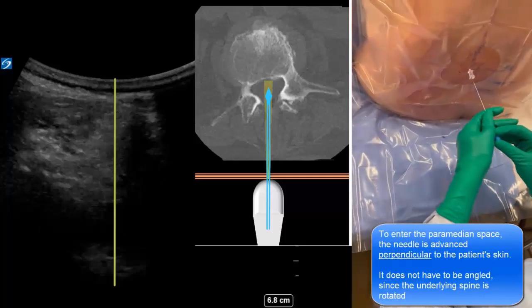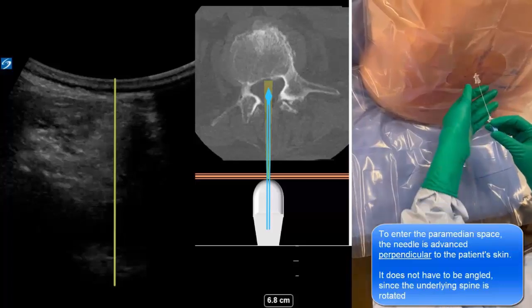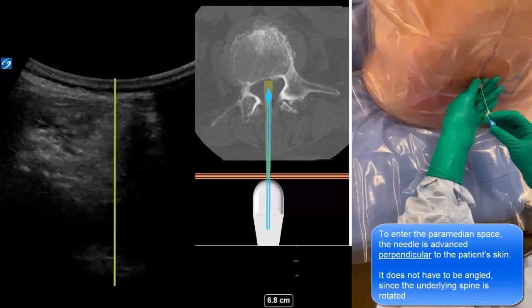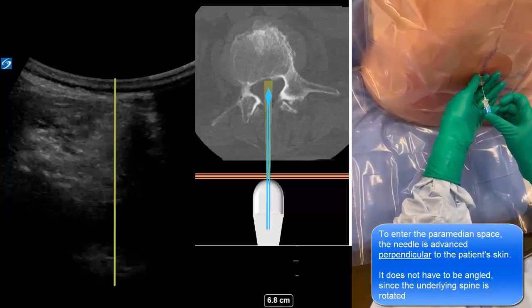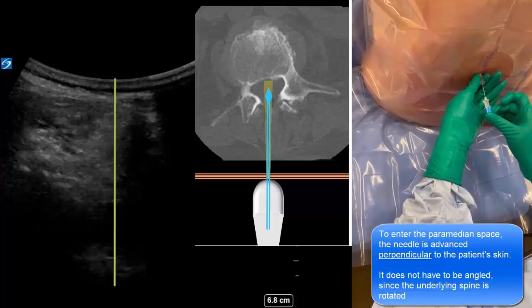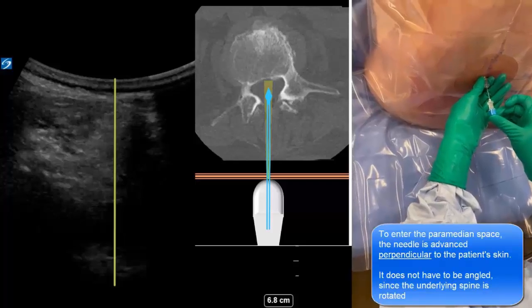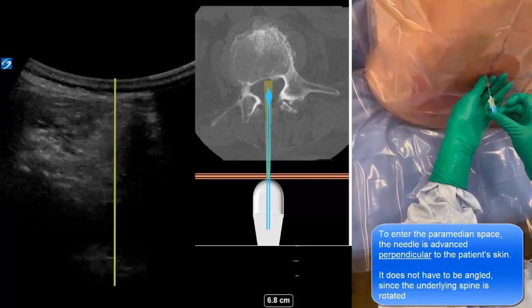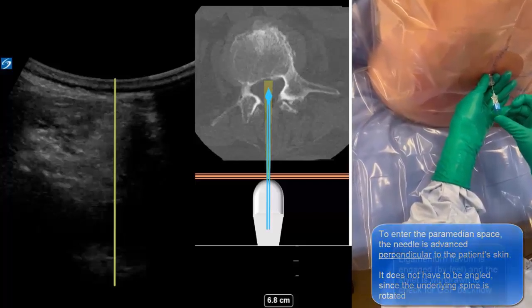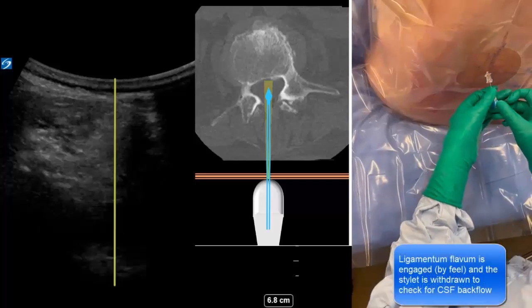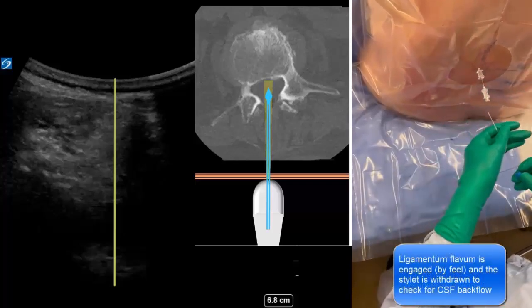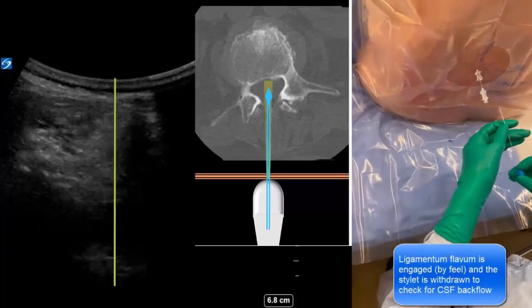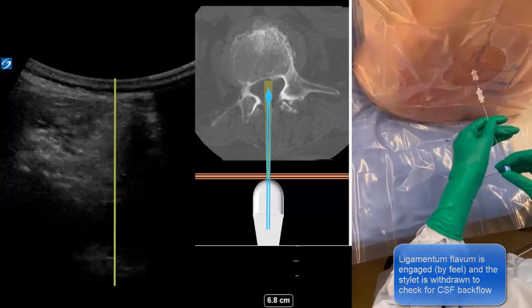Here we see our first-year resident using the imaging information and marks to successfully perform spinal anesthesia in a single pass. The spinal needle passes through paraspinal muscle to engage the ligamentum flavum and eventually enter the intrathecal space.